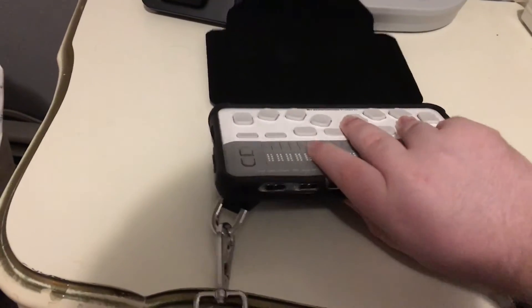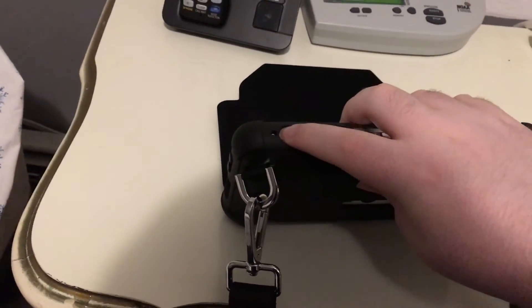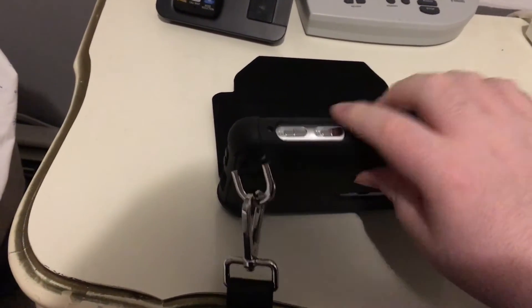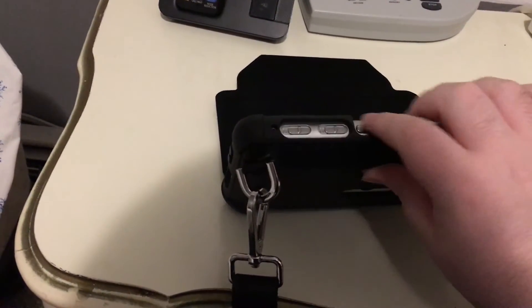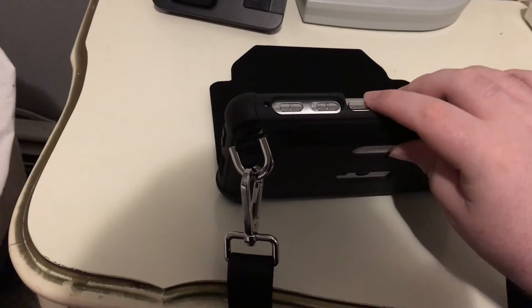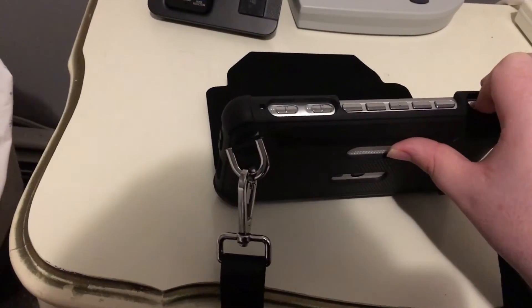Below the Braille display, you have a switch for locking the unit so that no buttons can get pressed. Then there's a switch that controls the mode of the media buttons — record, stop, play, and all that. To the right of that is your power sleep button.